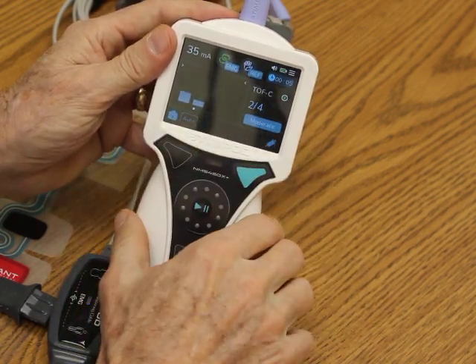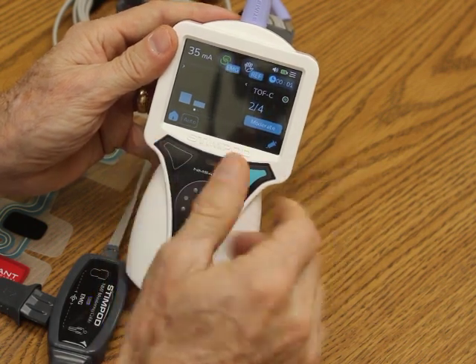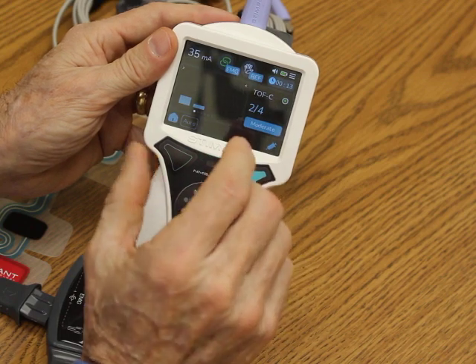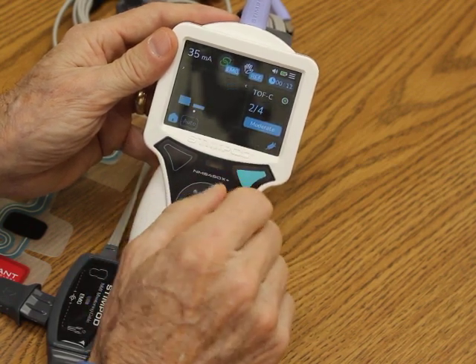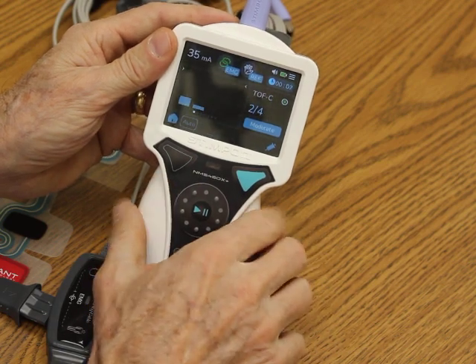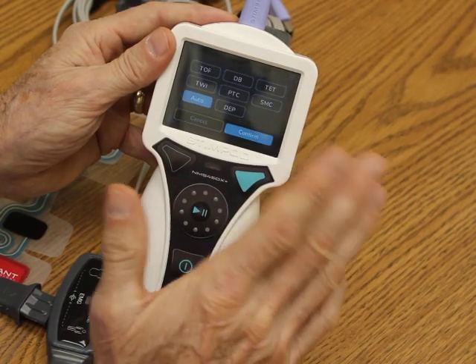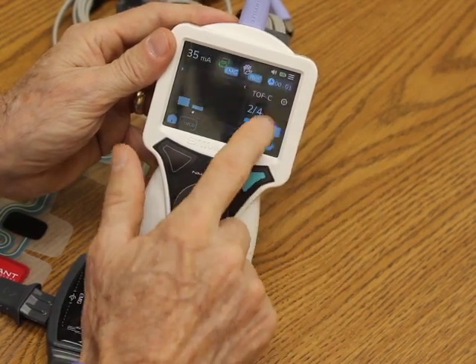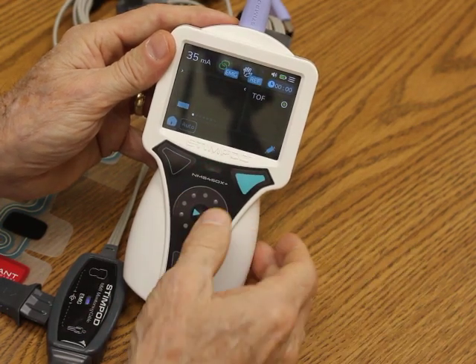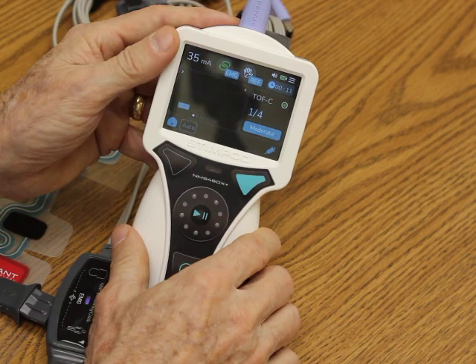Now we're starting to get paralyzed — the patient is at 2 of 4 and moderately paralyzed. Pretty soon we're going to get to 0 of 4. Once we get to 0 of 4, it'll switch to post-tetanic count automatically. Now if I wanted to get out of this auto mode, all I would do is press auto and choose train of four. I'm going to leave it in auto mode a little bit longer, but it's very easy to go to manual mode to do train of four as you want. Now we're at 1 of 4.